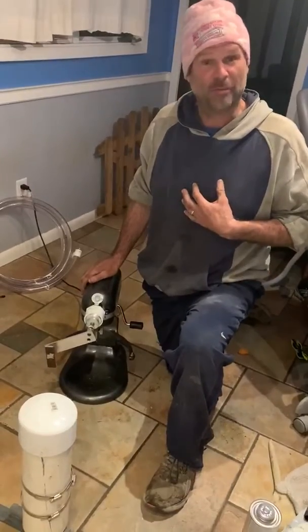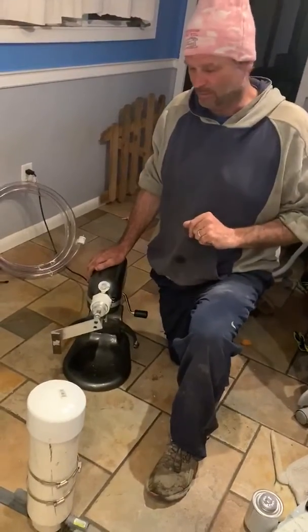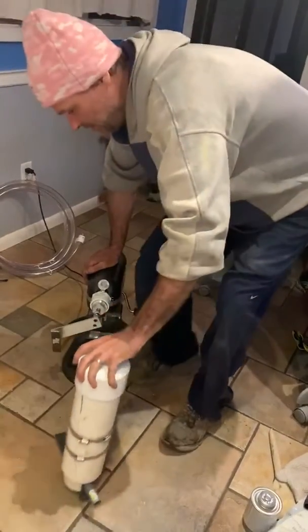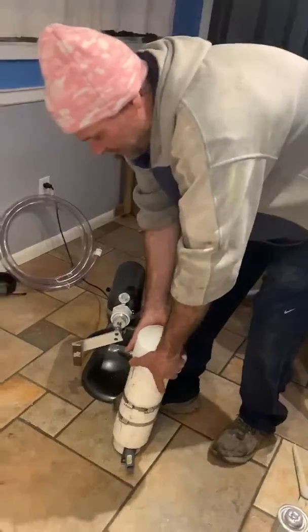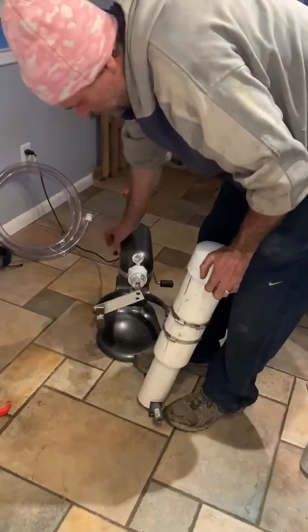I myself suffer from asthma, so I know what it's like not to breathe very well, and that would probably be why I'm working on this. What we've got here is a piston and vacuum device that will go up and down on the crankshaft of the mixer.